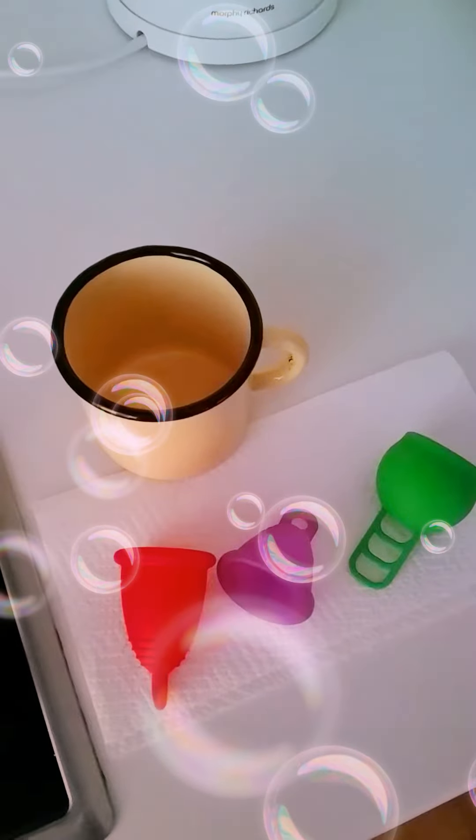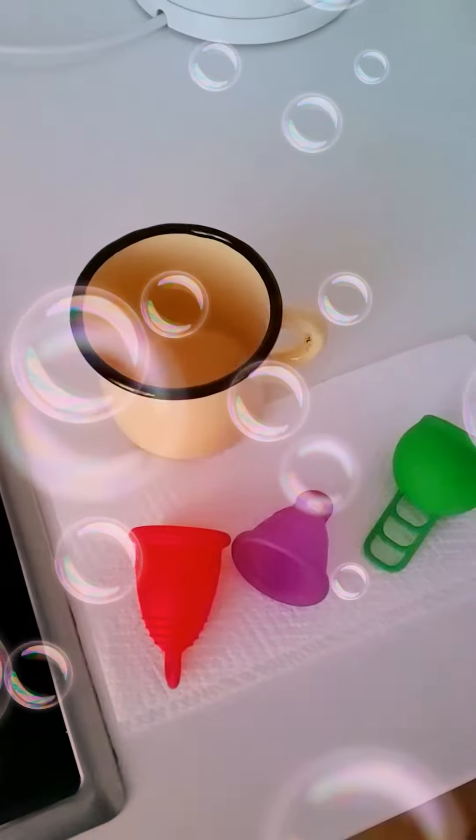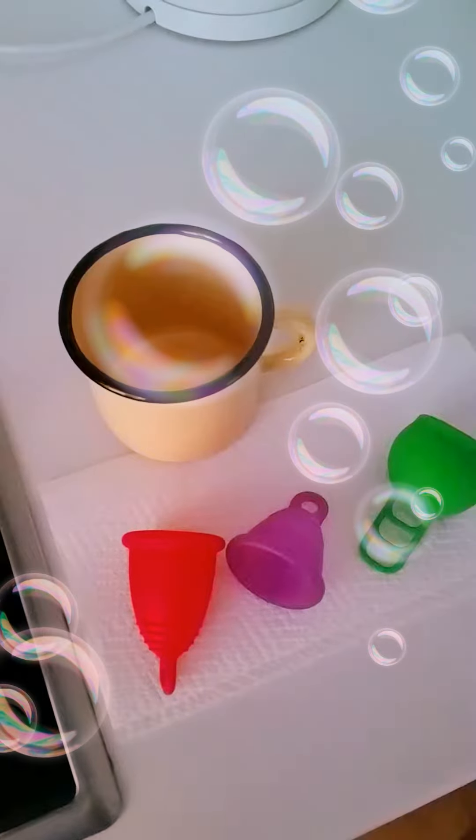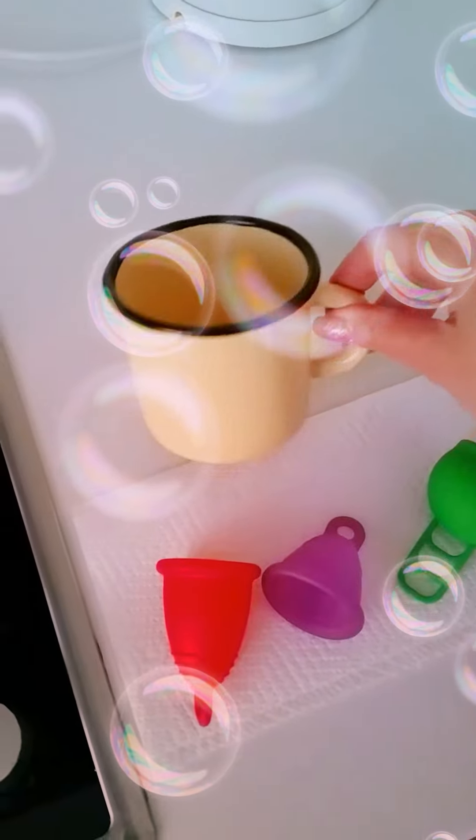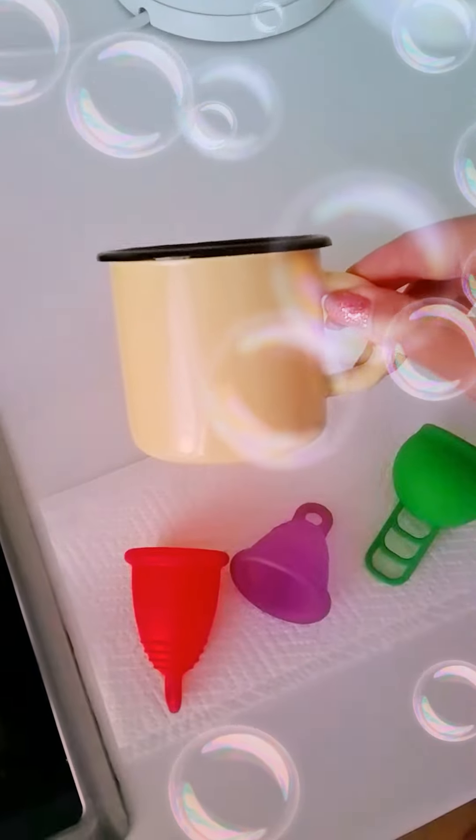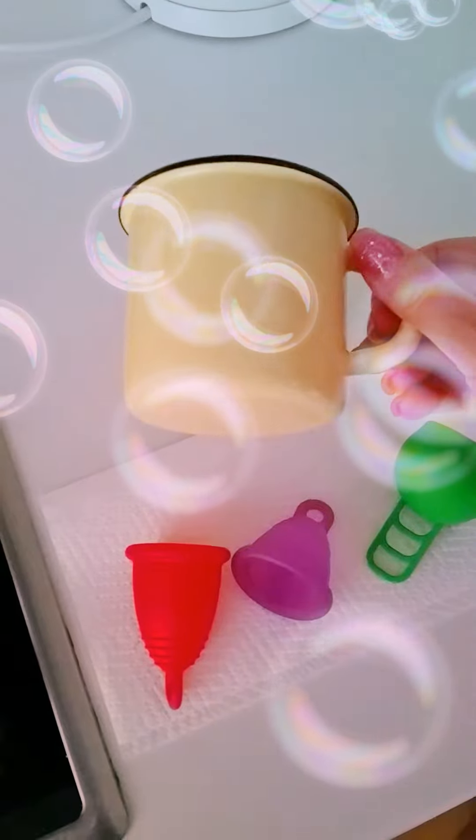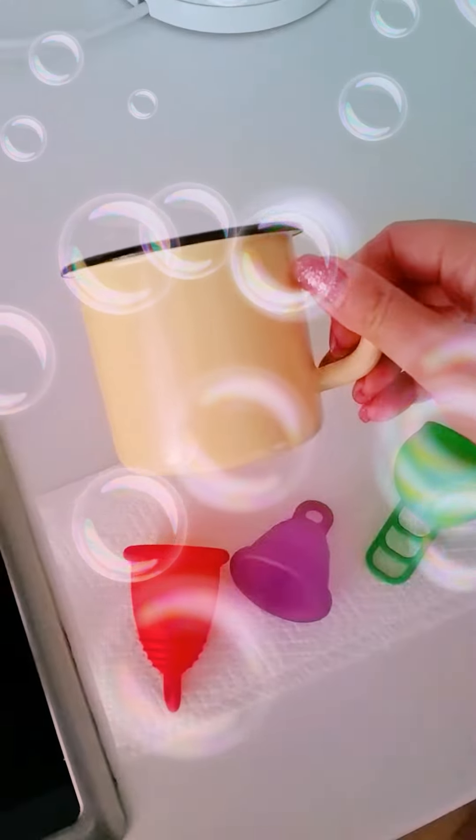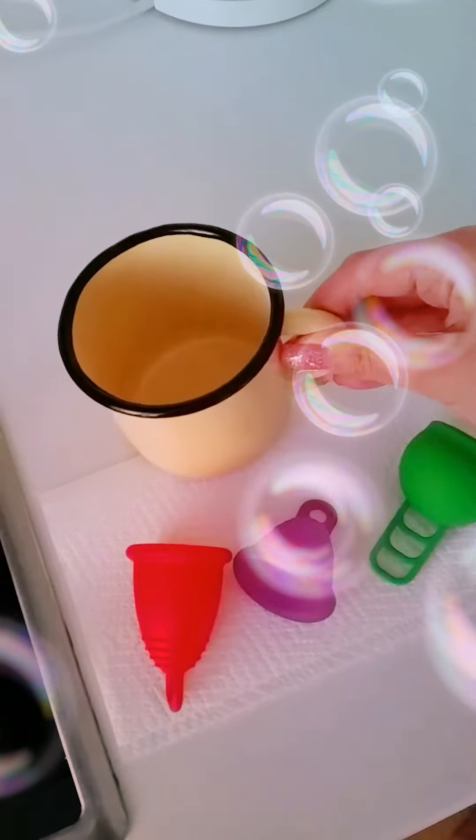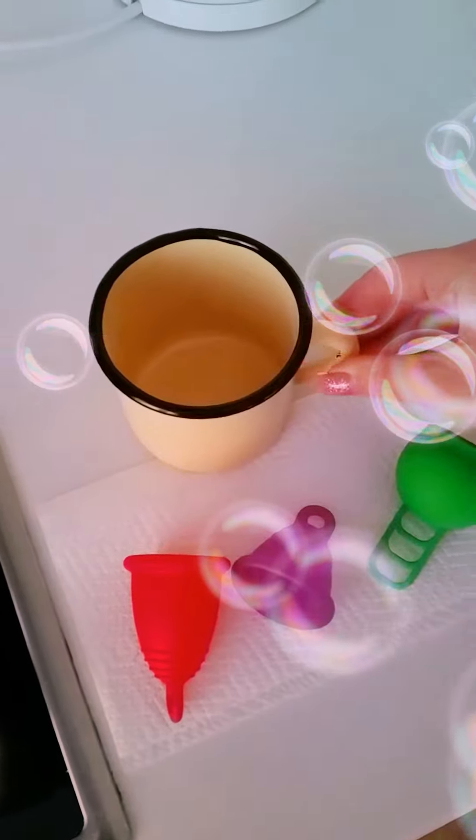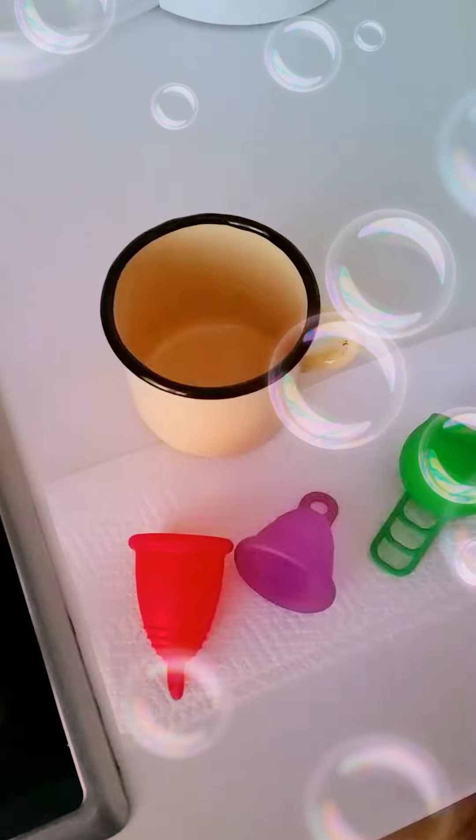Some people use normal pots. I decided to have a separate pot which is just like a cup. It's a normal size cup but it is metal.